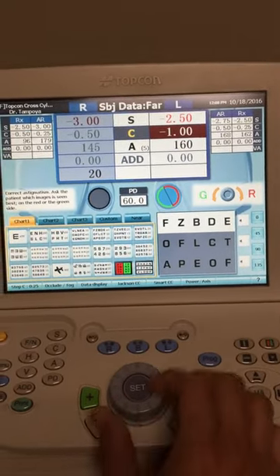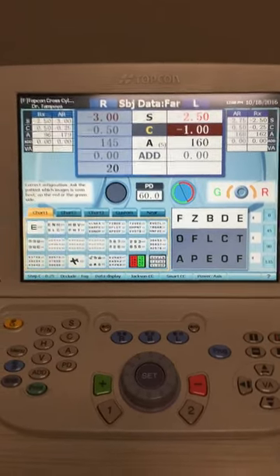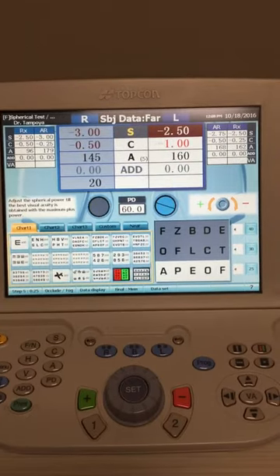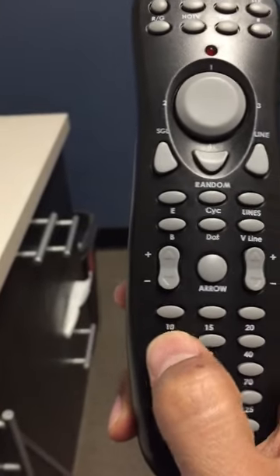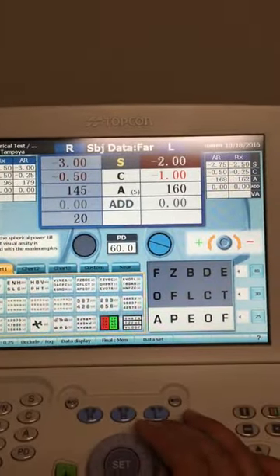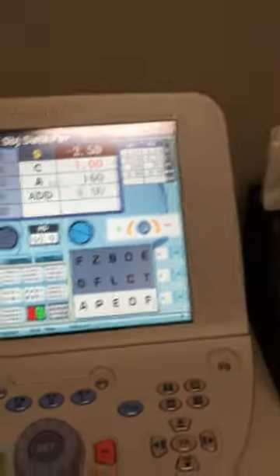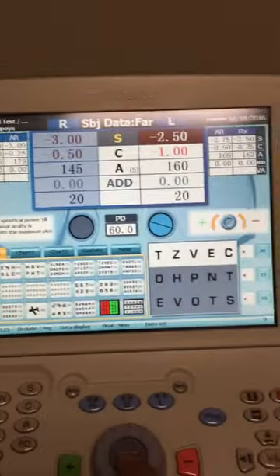When you increase the cylinder, the system will automatically bring down the sphere. Ask again which side is more clear — if they say about the same, stop there. Go up to the sphere and fog. I like to change the line, so I'll go to the remote and press 25 to change to a different set of letters. Then unfog by turning to the minus side until they can read. Go down to the 2020 line, change the letters by pressing 20, and if they can read those letters, put the VA as 2020. The left eye is done — press the button again.